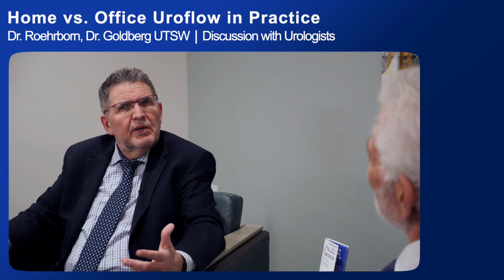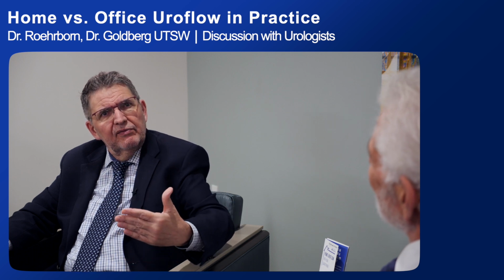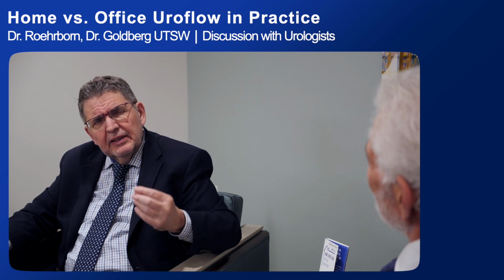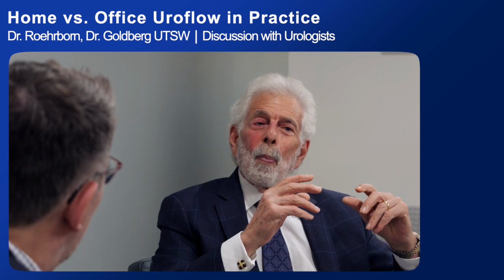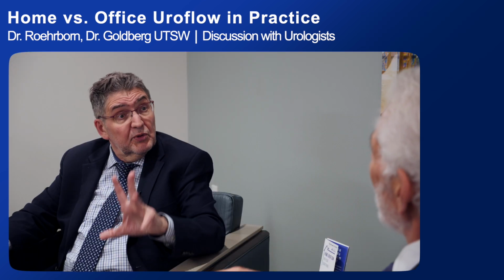So let me ask you this question. So I get it. They validated that the phone records the flow rate, and the volume that it records actually is the volume the patient urinated. And so how did they validate that the peak flow rate, which is a crucial number according to Paul Abrams and others, how did they validate that that's roughly okay? By measuring the rate of change in weight in the special commercial toilet with a scale on it, and by also having separate studies with volunteers who did a number of flow rates with the regular flow meter we have in the office and also with the iPhone. So those are the two parameters that are really vital. Correct.